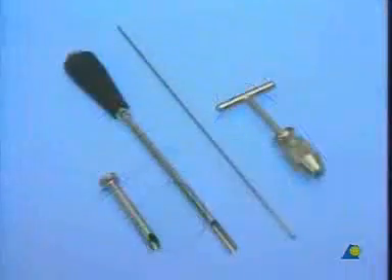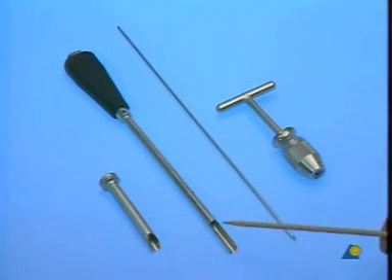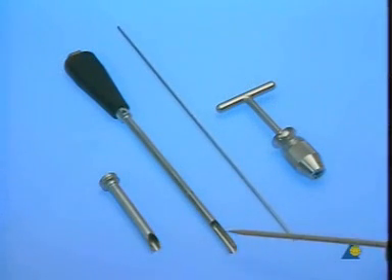The following instruments are needed to open the medullary canal: a T-handle used for the four millimeter guide pin, and a cannulated cutter with tissue protector.